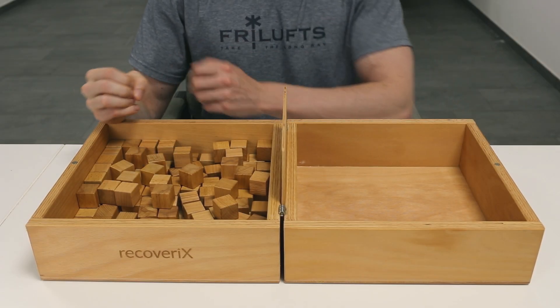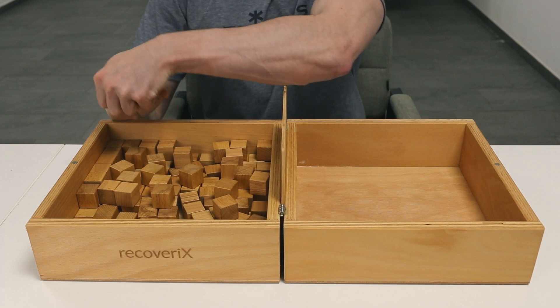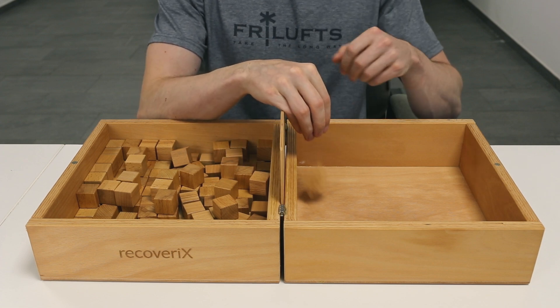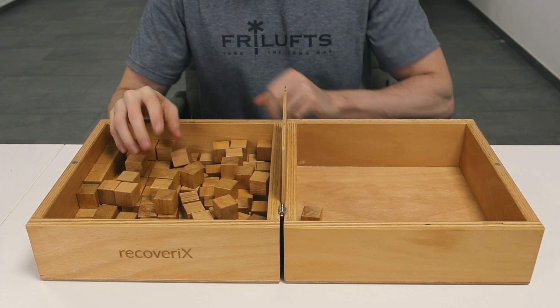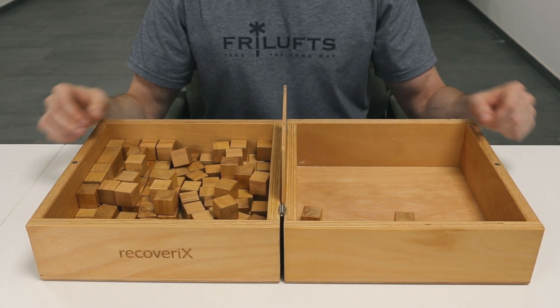One example is when the patient suffers from severe spasticity and requires their healthy hand to open up their affected hand. In this case, the patient can use their healthy hand to open their spastic hand. This constitutes a modified Box and Block Test, and you could note how often and after which number of blocks this stretching occurred.